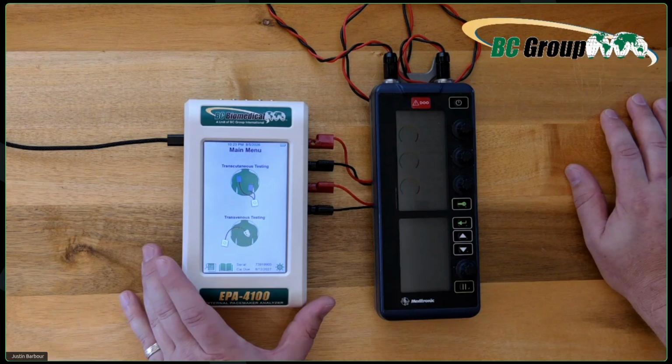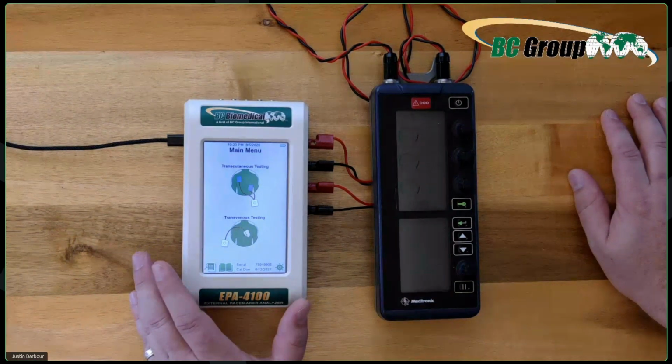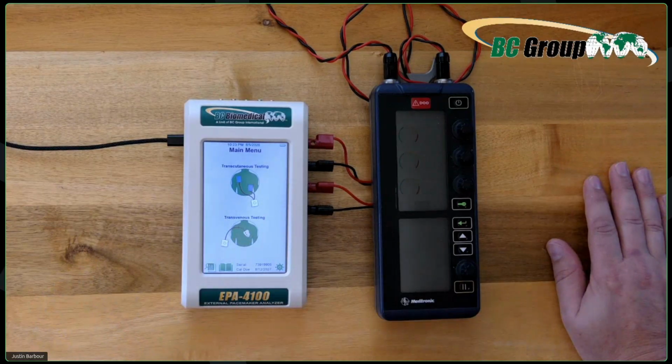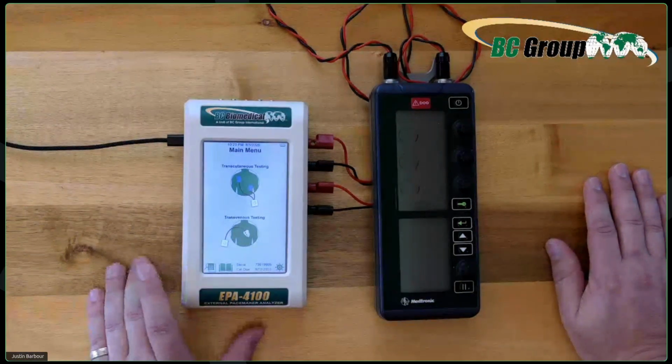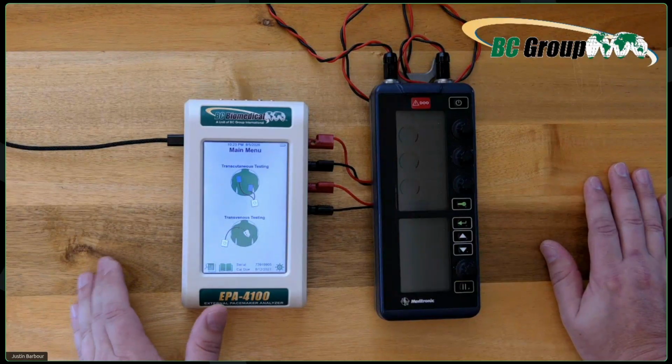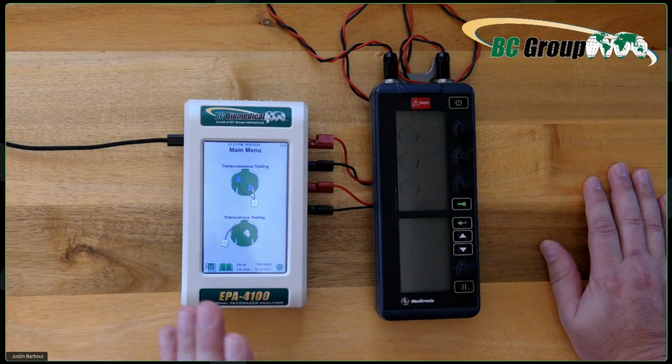And if you change anything about it, then you have to go all the way back through the 510(k) process. So let's say I wanted to add a whole other menu option, I would have to go through the whole process. And it takes a long time, and it's a very expensive process. So this is a really good opportunity, guys.